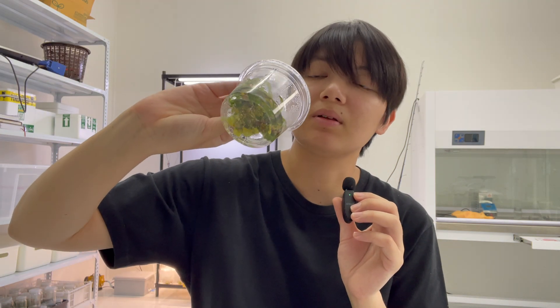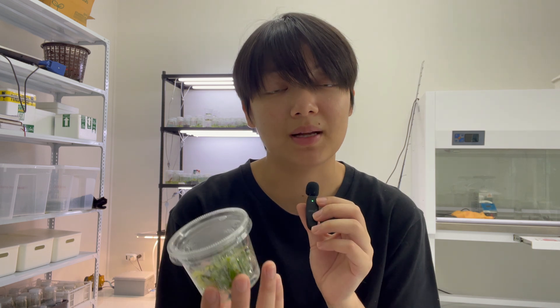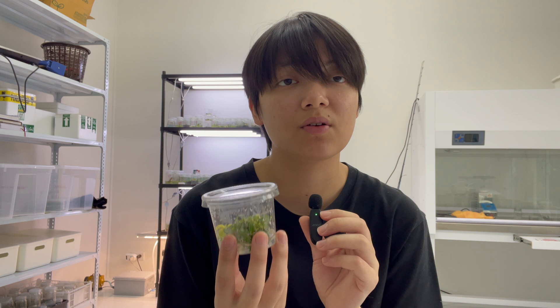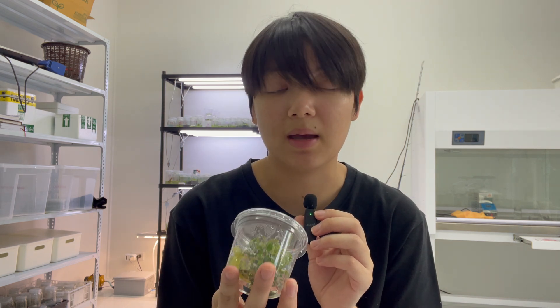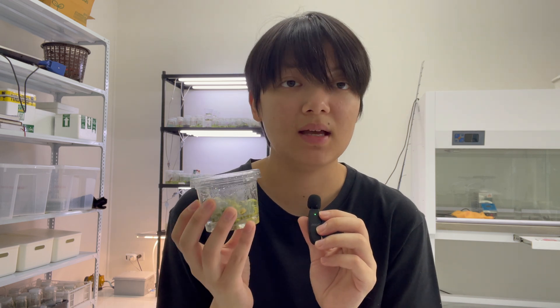Now let's talk about the disadvantages. The clear disadvantage is that you should expect a higher rate of contamination in your lab. If you're not sterilizing all your tools and jars, you're going to get bacterial or fungal contaminations in your agar and media. Because we're using PPM, it suppresses the growth of those bacteria, so you won't see contamination right away — but after a few subcultures, signs of contamination can become quite obvious. The second disadvantage is that the shelf life of the media is going to be shorter.